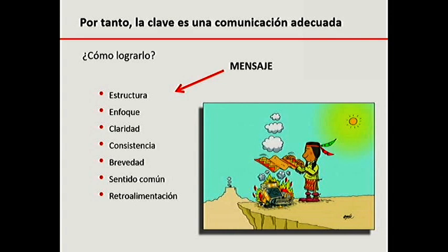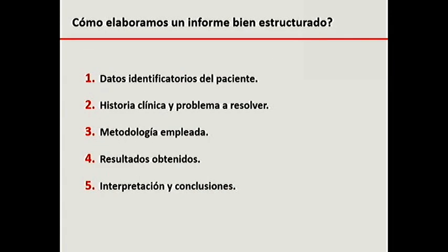And feedback is practically to see what is the opinion of the physician in relation to the reports that we prepared. Was it relevant? Was it useful? Was it not? And so on. So this is the structure of the report.